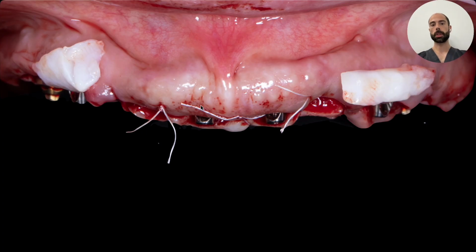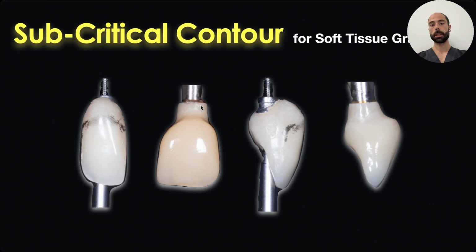This is why we perform connective tissue grafting simultaneously at the time of the implant placement, or at the second stage even, full arch side by side wherever the tissue envelope needs building. The evidence is clear on this. Thicker peri-implant mucosa correlates with better marginal bone stability and better aesthetic outcomes long term. Now, to allow the graft to heal, mature, and actually grow, you need to give it space. This is where the concept of subcritical contour becomes essential.